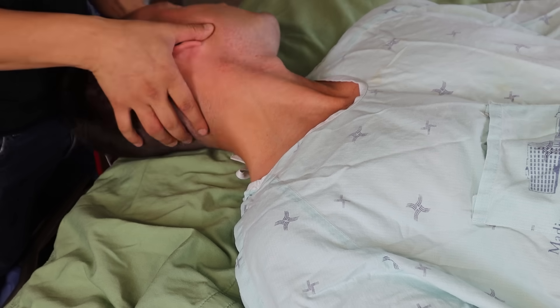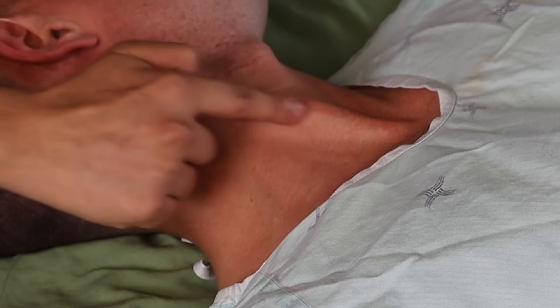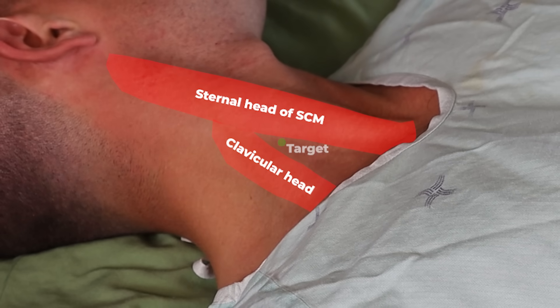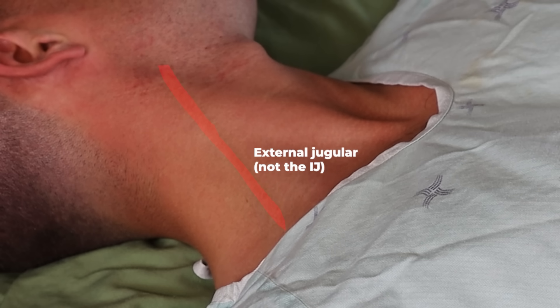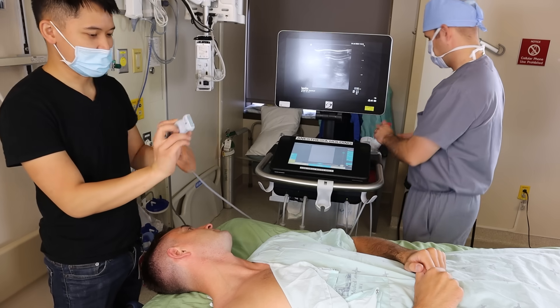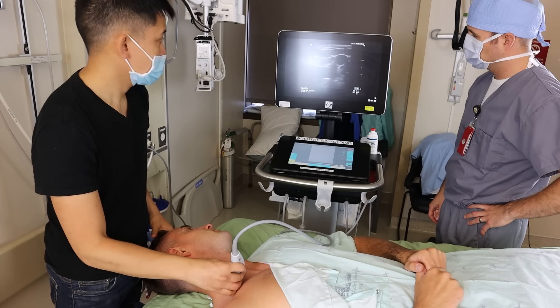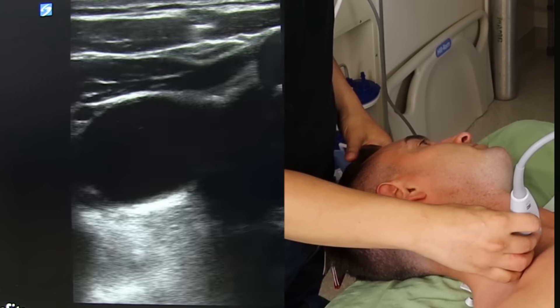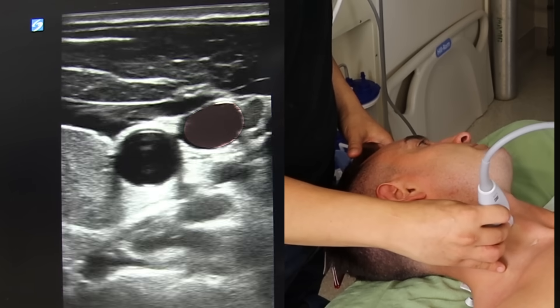Let's have a look at some landmarks. We'll do the line with ultrasound — that is absolutely the standard of care and what you should be doing. But in the old days, people used the two heads of the sternocleidomastoid, the sternal head and the clavicular head, which form a triangle whose apex marks the vein. Always look at the site under ultrasound before you drape to make sure it's suitable. I start by tracing the jugular from as far inferior as I can and then up to the angle of the mandible so I can fully understand its course.